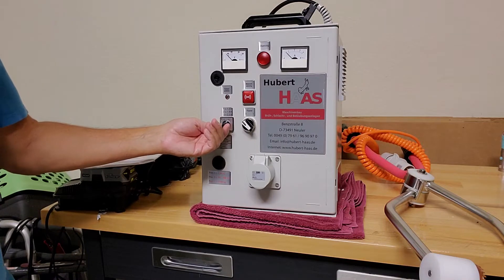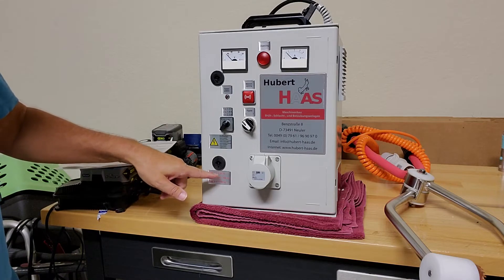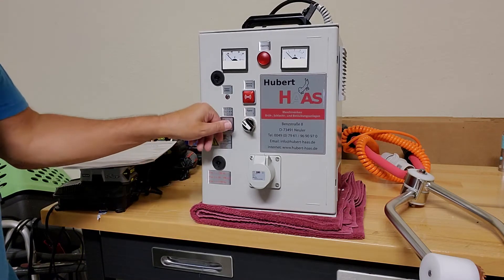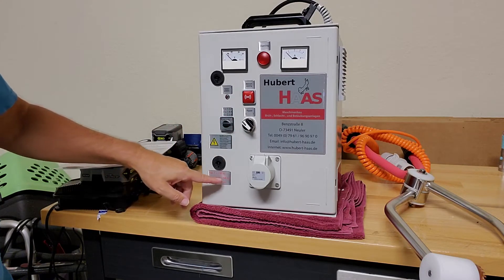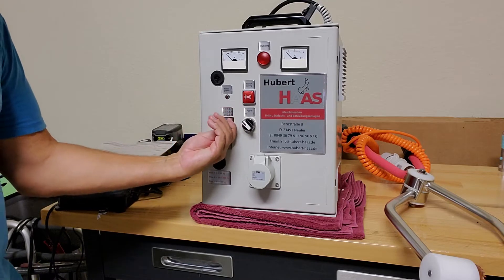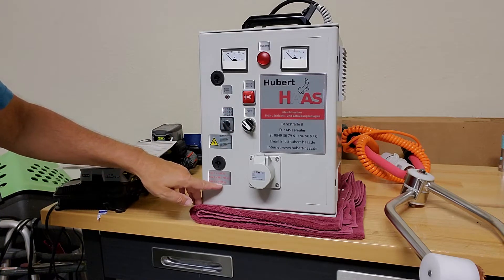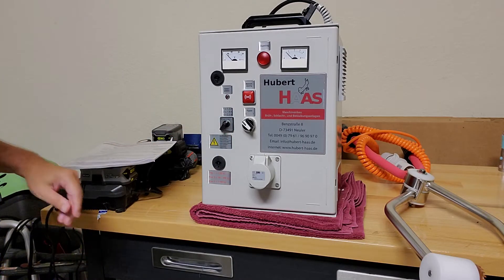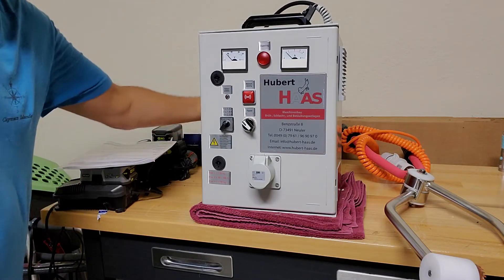Depending on the size of the animal you're euthanizing, position one is for less than 50 kilograms — that's marked right on the stunner. Position two is for 50 to 100 kilograms, and position three is for greater than 100 kilograms. I've already got it plugged in; this unit is for 110 volts.